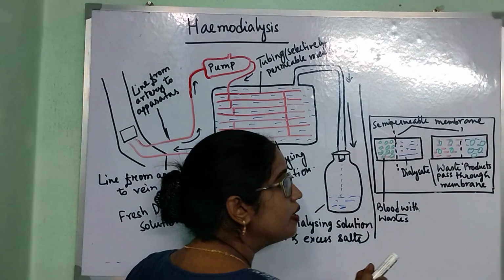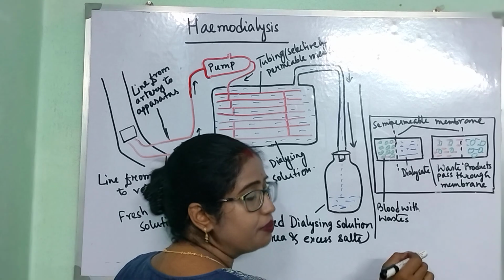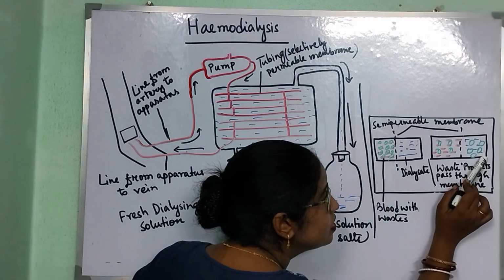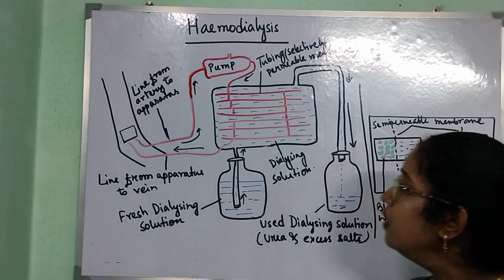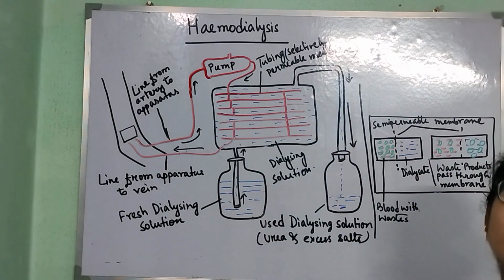After some time, via the diffusion process, the waste material passes into this dialysate solution and the blood becomes purified.